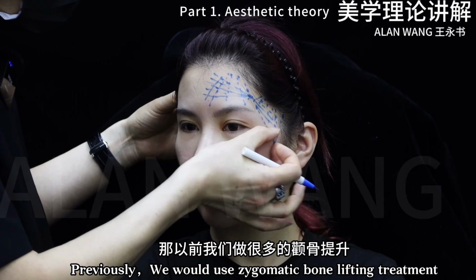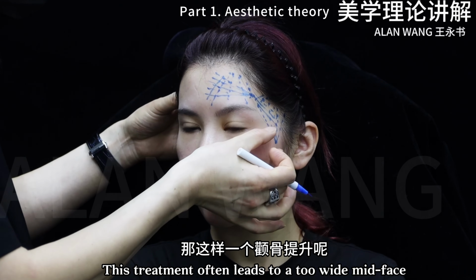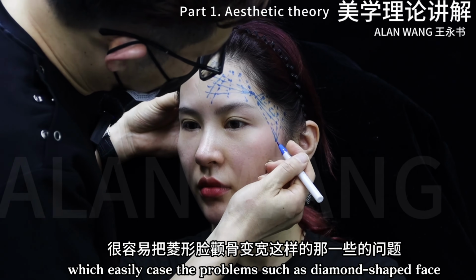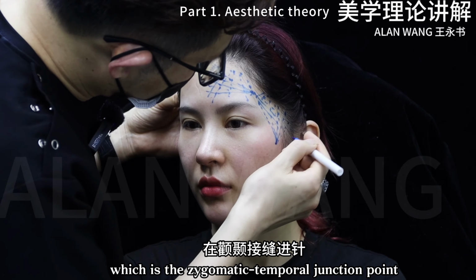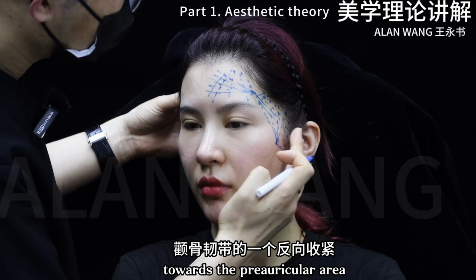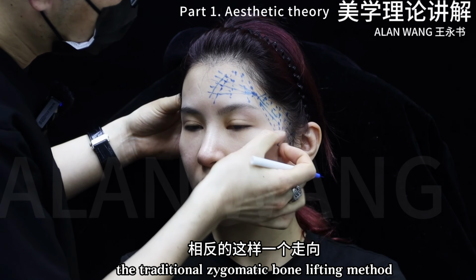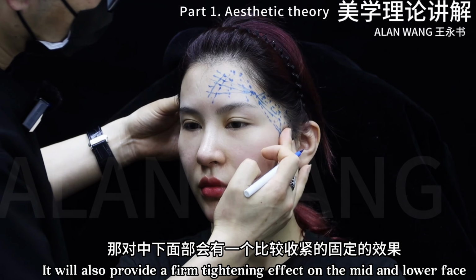Previously, we would use zygomatic bone lifting treatment. This treatment often leads to a too wide middle face, which easily causes problems such as the diamond-shaped face. So, I would choose the same entry point, which is the zygomatic temporal junction point. Perform a reverse tightening of the zygomatic ligament towards the preauricular area. This is the opposite direction compared to the traditional zygomatic bone lifting method. It will provide a firm tightening effect on the mid-face and the lower face.